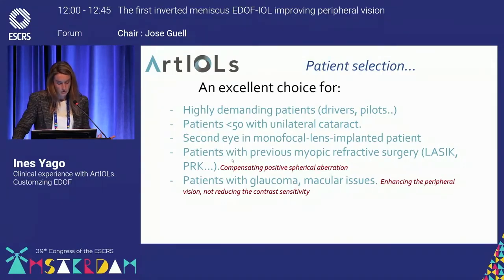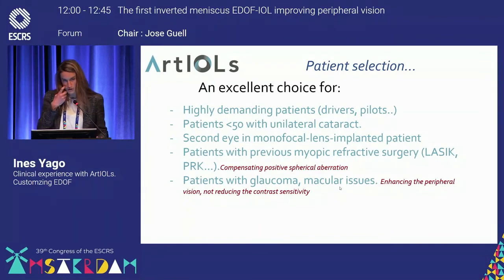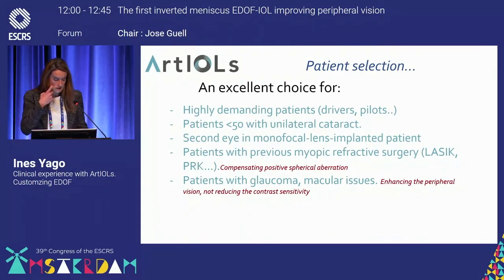And in particular, 2 groups of patients would be really suitable for these implants, as they are patients with previous myopic refractive surgery with some additional positive spherical aberration. So we are compensating that excess of spherical aberration, and all those patients with glaucoma or maybe some kind of macular issues, because we are enhancing the peripheral vision. That might be a good point in some of them in the future. And we are not reducing the contrast sensitivity that it's also important in that group of patients.